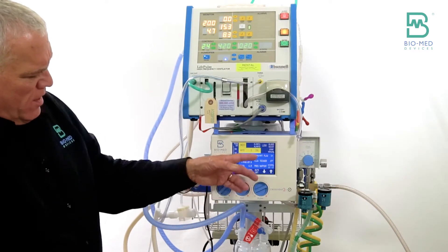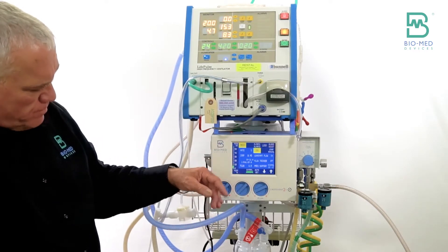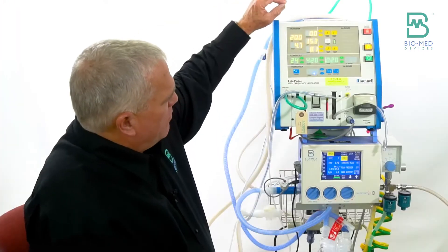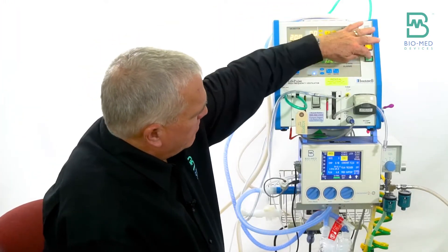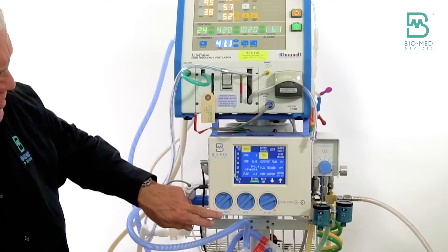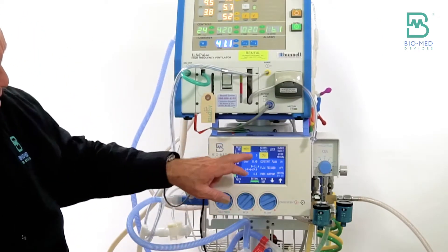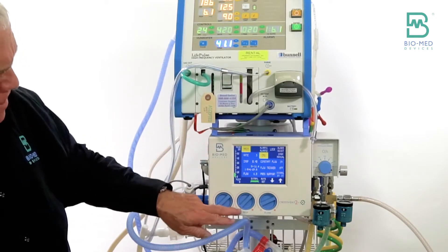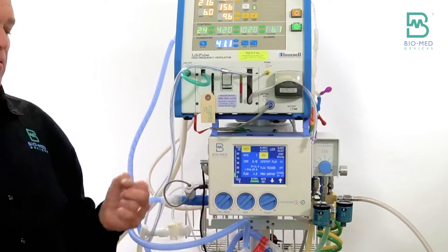Probably most of the time when you set up the Cross Vent with the jet, you're going to start in CPAP mode, just because the nature of what drives you to put a kid on the high-frequency vent means you want to limit the amount of conventional breaths you give. But for the sake of ease, I'll set my I-time, start the jet, and set the rate to five for now.